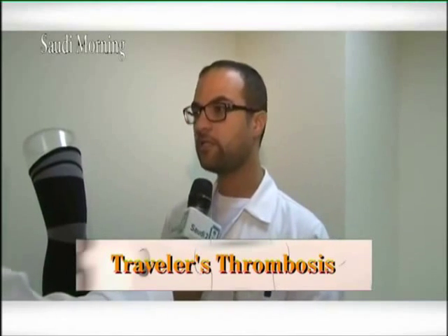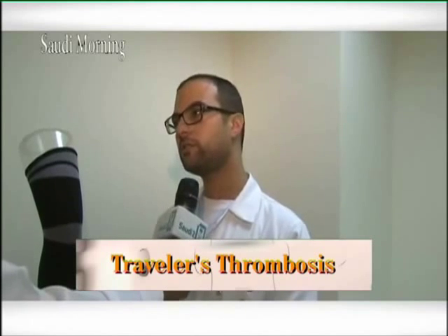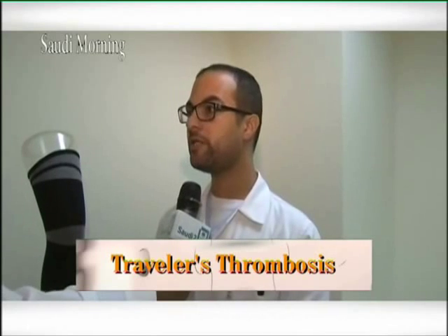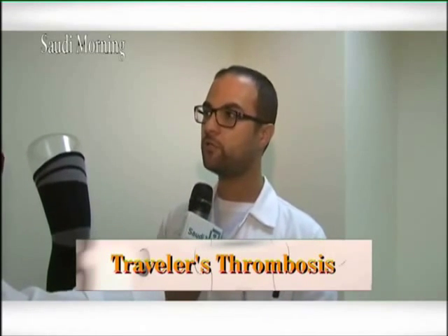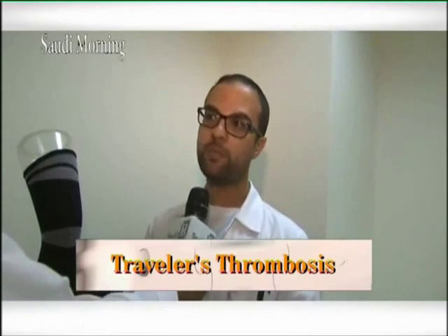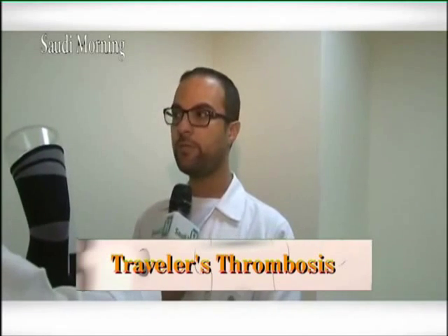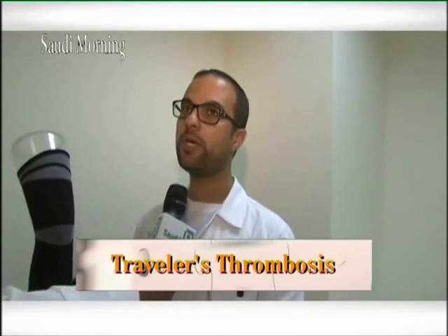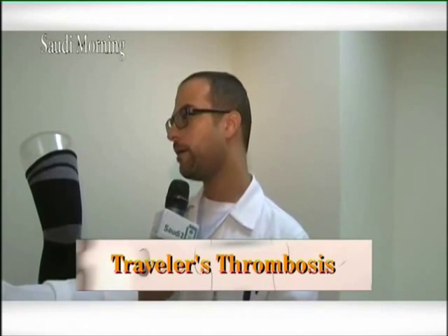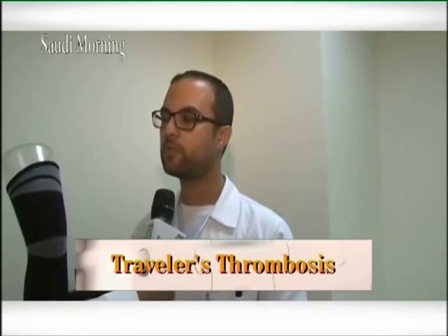The most difficult cases that come to our clinic are patients with severe conditions and progressive swelling. Sometimes we can give a ready-made pressure garment, which is easy to fit for the patients. But sometimes patients come with severe edema, and a ready-made garment is difficult, so we need to make a custom-made one for the patient. This process takes a long time, and then the patient can take his own pressure garment.